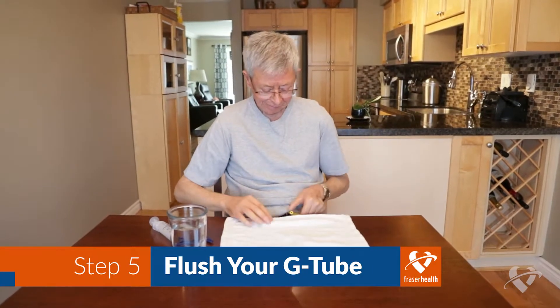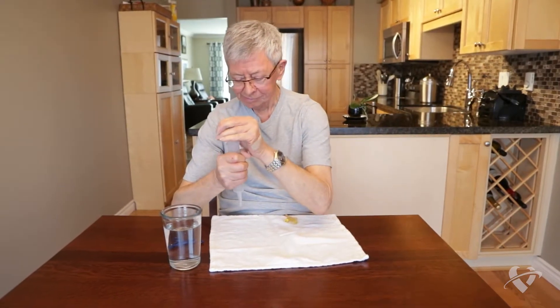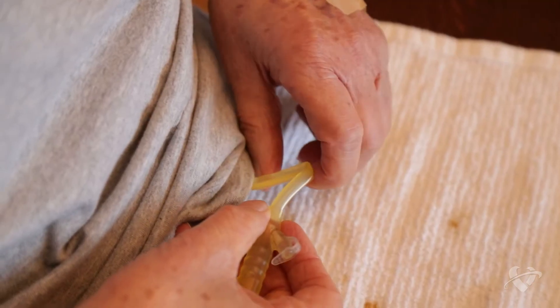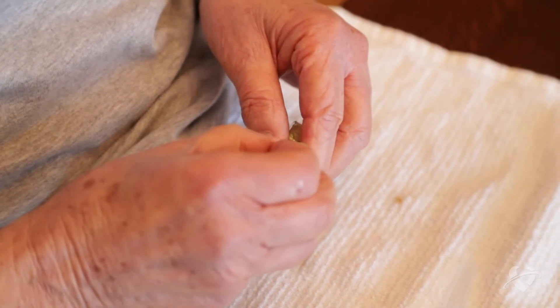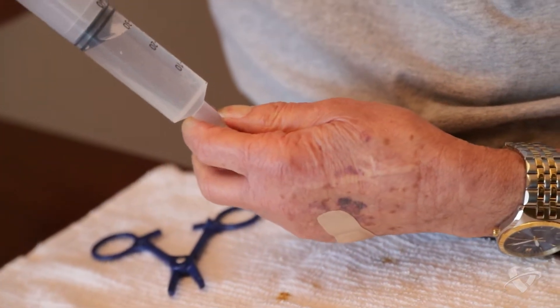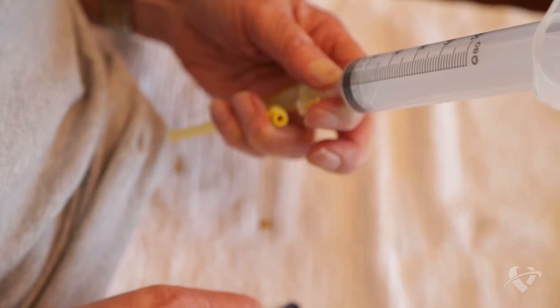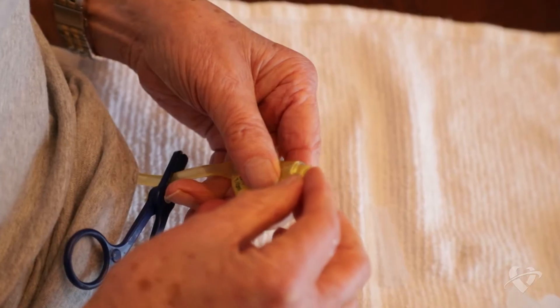Flushing your g-tube before feeding yourself helps to clear anything that might be blocking it. Using your syringe, draw up the recommended amount of water or at least 30 milliliters from the container. Clamp or pinch the g-tube with your fingers to prevent stomach content from leaking out. Uncap the feeding port and insert the tip of the syringe. Release the clamp or unpinch the g-tube before gently pressing the plunger to push the water through. Once again, clamp or pinch your g-tube before removing the syringe from the feeding port and replace the cap.